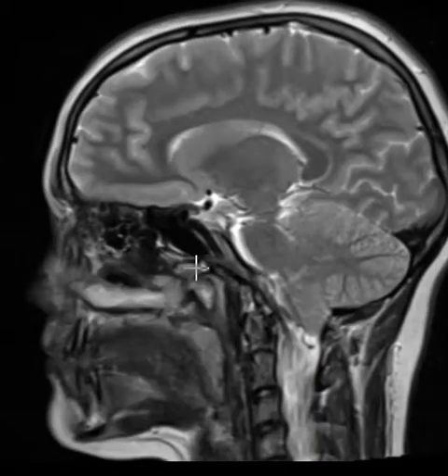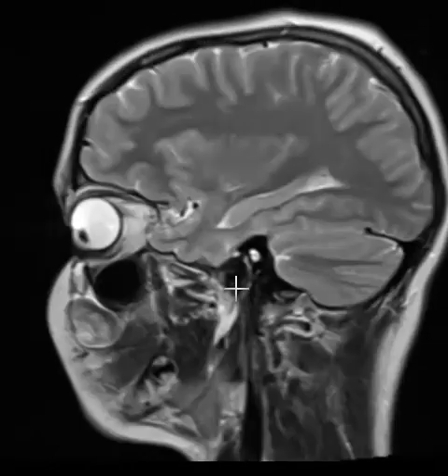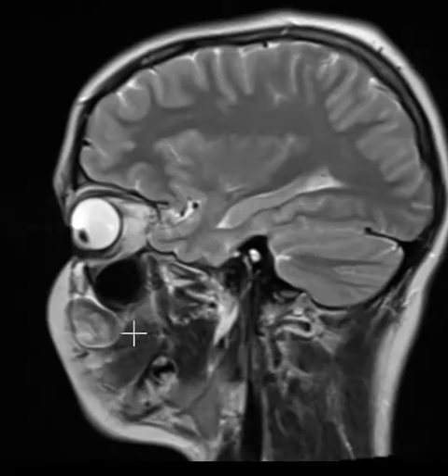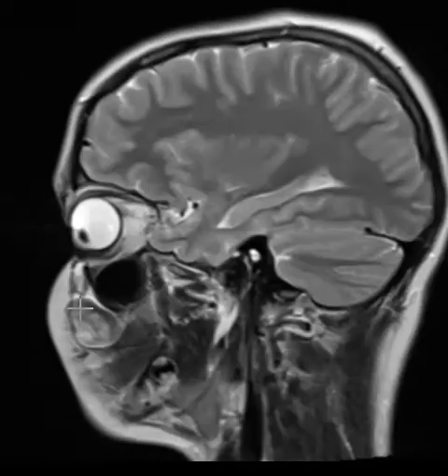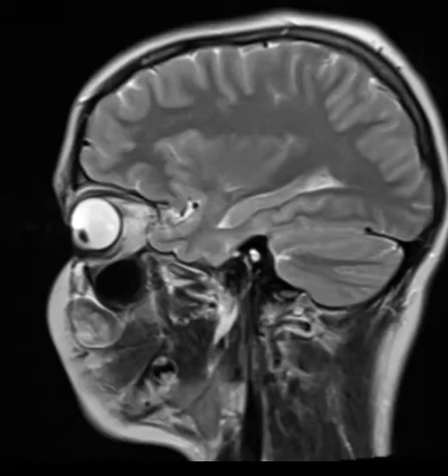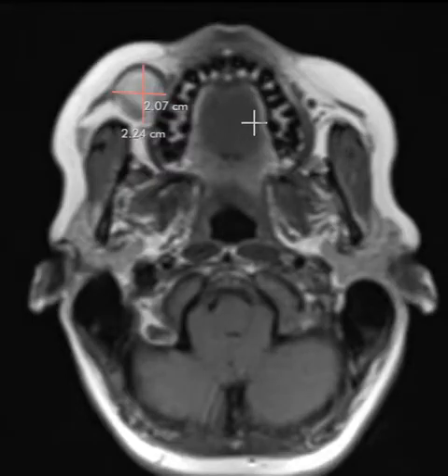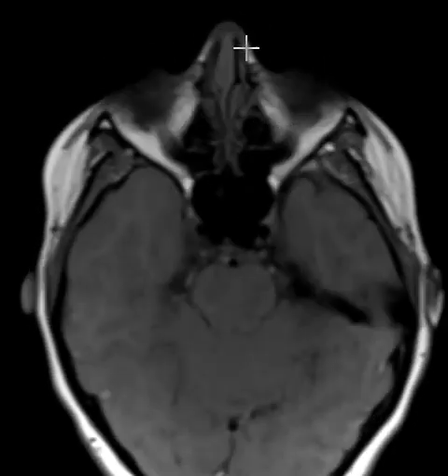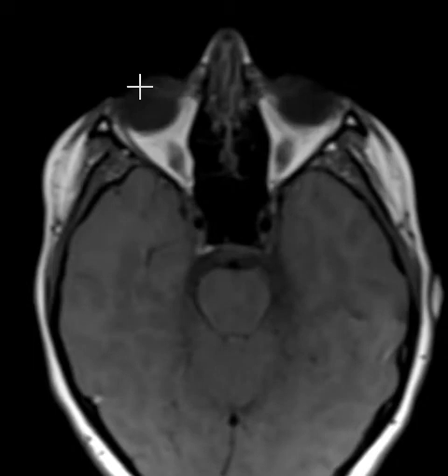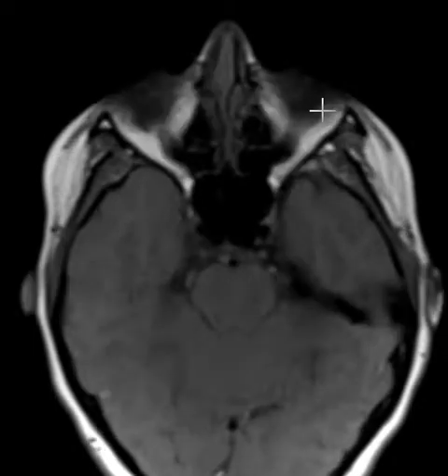Now we're going to go on to the face, and on the face we do see there is a sharply defined abnormality here in the right face. This is the soft tissue mass they feel clinically. When we do axial images like this, we can see the nose here, here's the right eye.